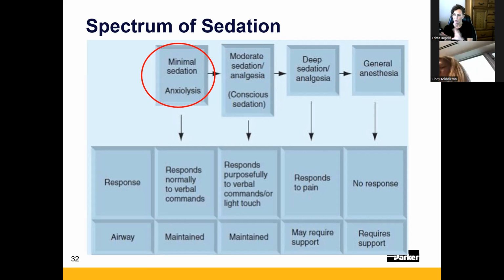It is, again, used for repairs, used for tough placentas. It's used for versions. It's used for balloon placement. And it's used if you check her, and every time you check her, she's climbing up the head of the bed. This is an option for her.